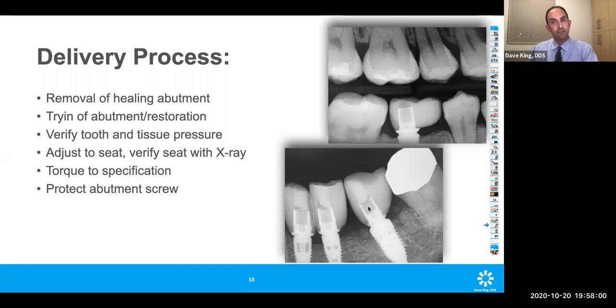In some indications, though, depending on the thickness that you have, a metal restoration, whether it's a full titanium abutment, or a PFM bridge or implant restoration may be better. It just depends on the situation. But personally, I'm comfortable using these ceramics, following appropriate recommendations and in the right indication, for just about everything, because that's what we do all day anyway.